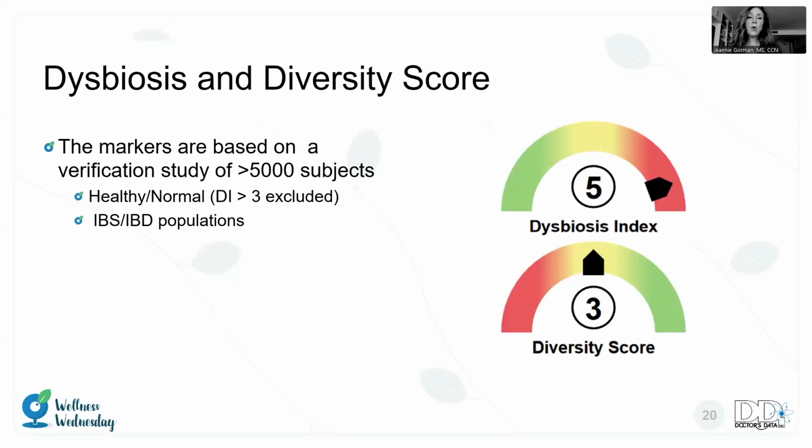Let's look at these scores. Just a little bit of background. They're based on a verification study of more than 5,000 patients. So we update these every 1 to 2 years. So we're always looking into the current statistics here.